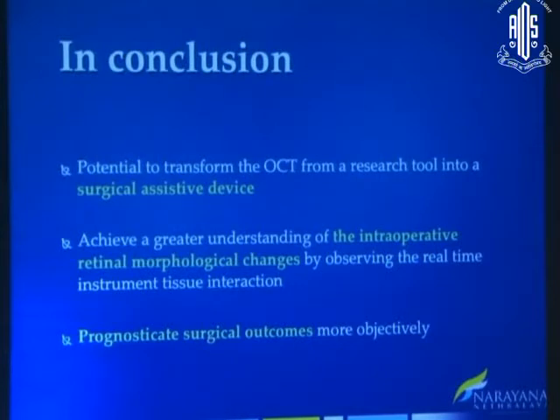In conclusion, the MIOCT has the potential to transform OCT from a research tool to a surgical assistive device. You can achieve a greater understanding of the intraoperative retinal morphological changes by observing the instrument and tissue interaction, and it can also help prognosticate surgical outcomes more objectively.